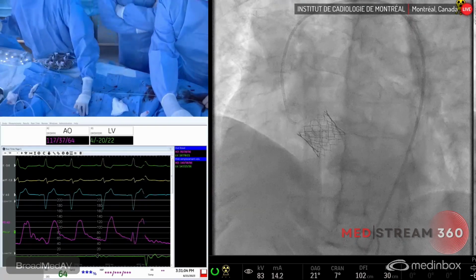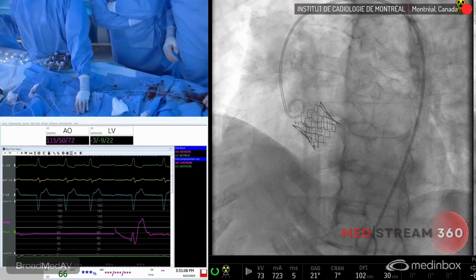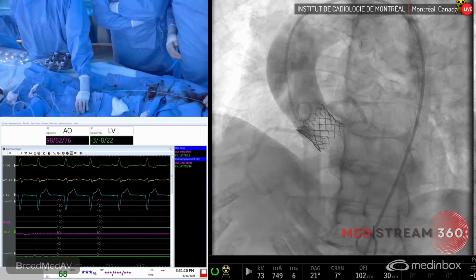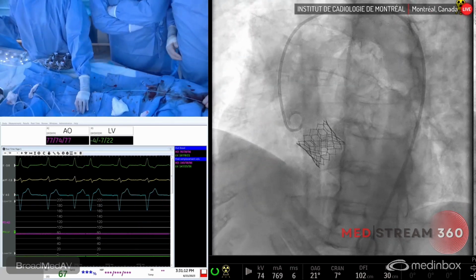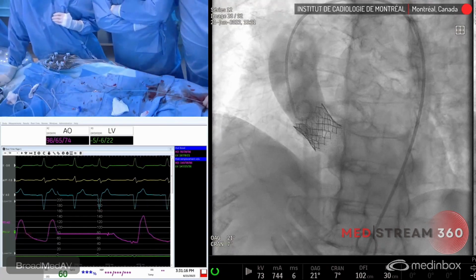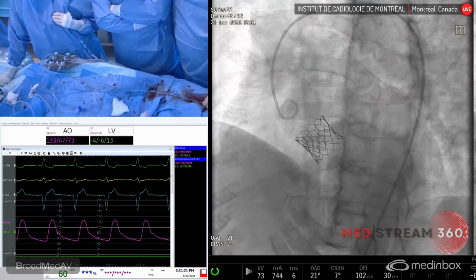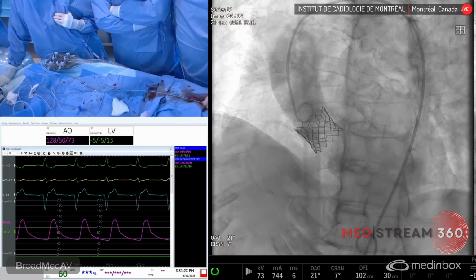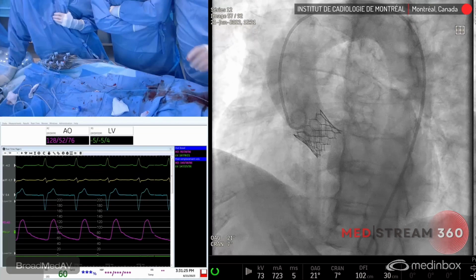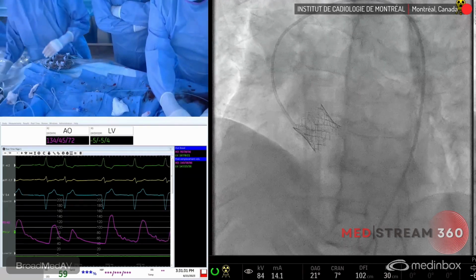okay, you want to just hold it there? Okay, I'll do an angio, Cine, please. Okay, so we see nice filling of the left coronary. The big window of the Sapien is in front. That's perfect. We see nice filling of the left. Don't see much in the way of AI. There's a little bit there, but one leaflet is not moving. So Raul thinks there's a lazy leaflet.